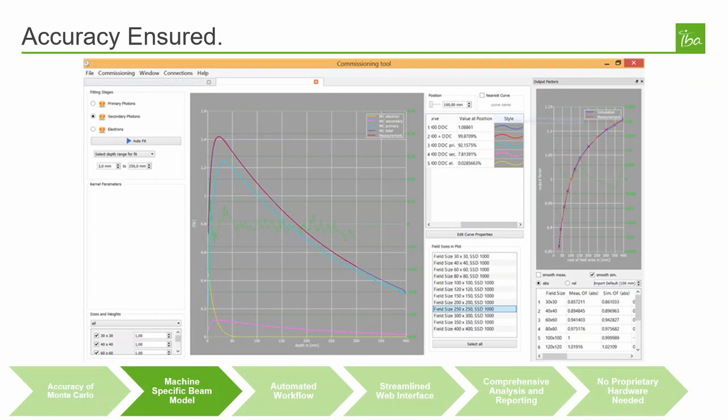Additionally, there are many international recommendations for independent audit of the data by a qualified medical physicist, such as AAPM Task Group 106, Task Group 53, and ESTRO Booklet 10. This is why we provide you with the beam model check as a complimentary service with the purchase of each SciMoCa beam model, or as a standalone service. The report will detail all possible inconsistencies and errors with their potential sources.